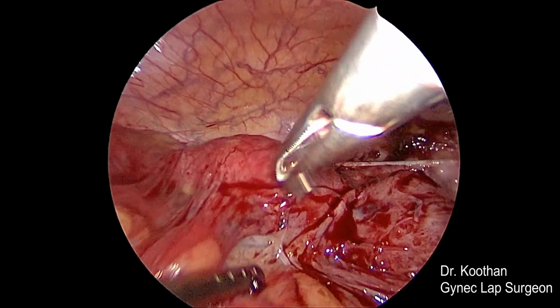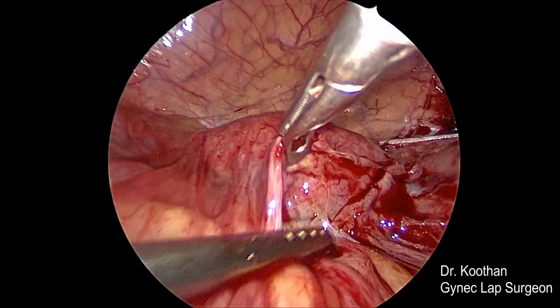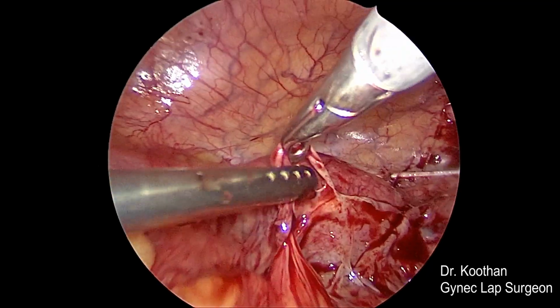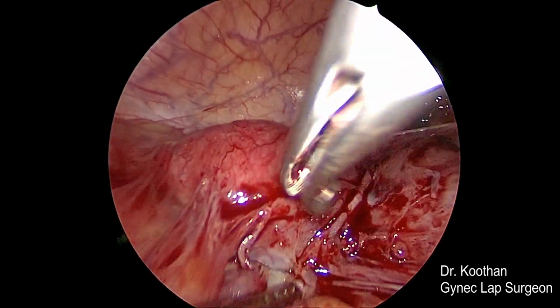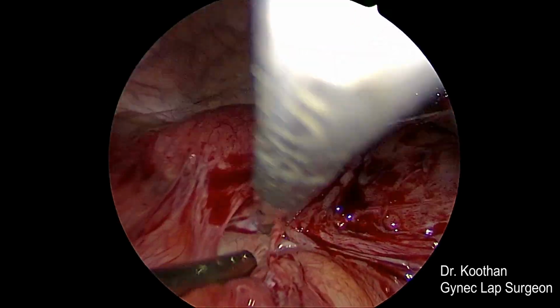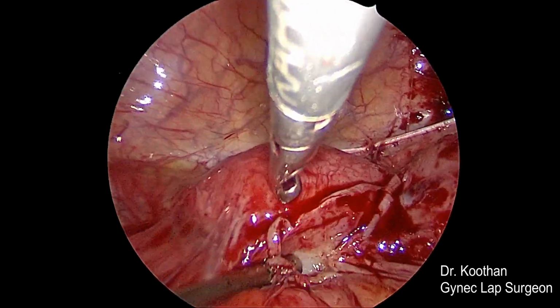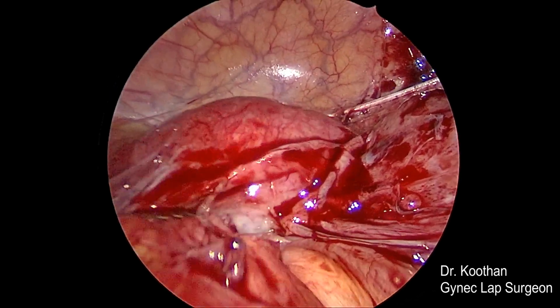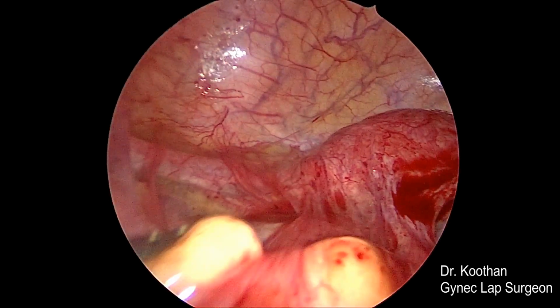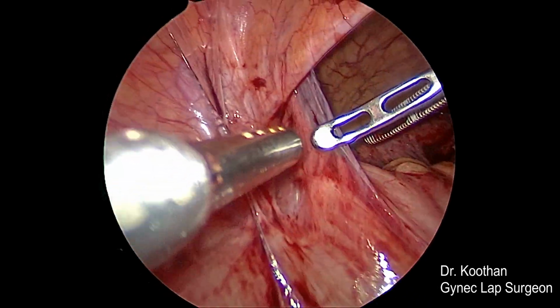Now we have started dissecting the adhesions over the anterior surface of the uterus. What you can see is that the sigmoid, which is densely plastered to the anterior surface of the uterus, and now we are slowly releasing it. This is the sigmoid adhesion.